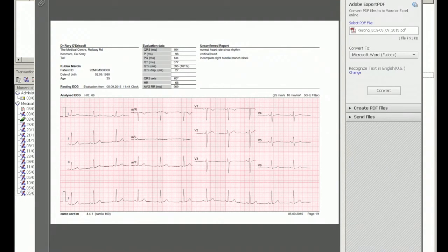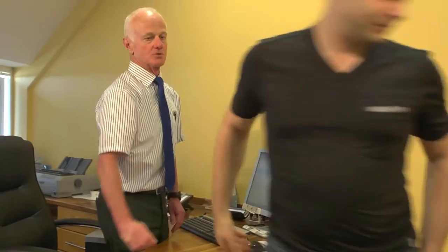The tracing looks perfect. The doctor explains there are no worries, and that this ECG will be considered a baseline — held on file to compare with future ECGs going forward. Everything is absolutely normal at the moment. The consultation concludes and Martin is thanked for coming.